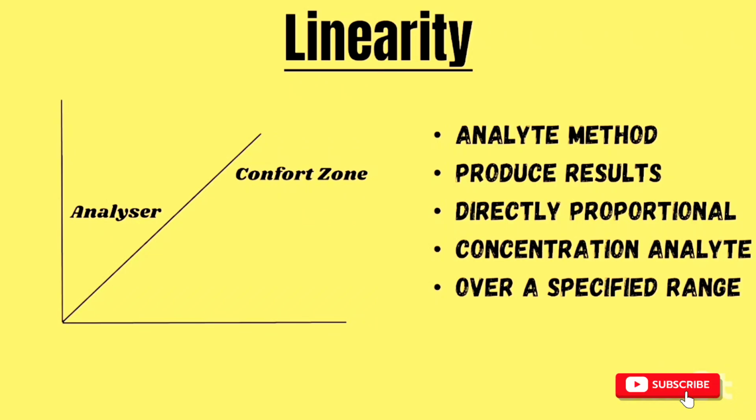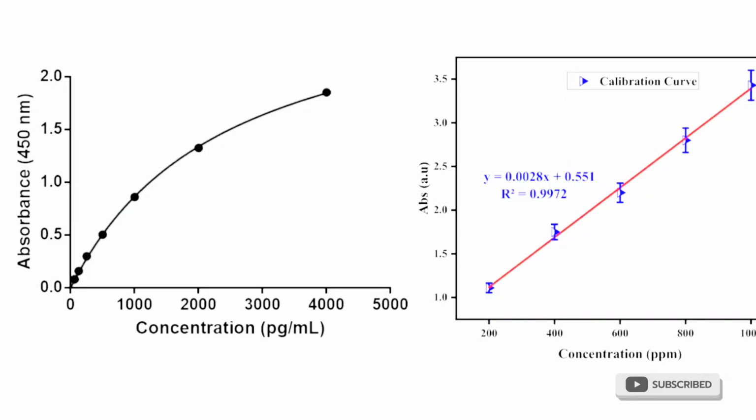Okay, all right, fine. Now, this is also another way I want to explain this, just to help us have a better understanding. So you can see these are concentration, these are absorbance. I just want you to have that understanding. So this is a standard curve. The same thing is applicable here. So what you really want when you do a calibration is for your R-squared to be as close to 1 as possible. In fact, if it is 1, that is even perfect, okay?